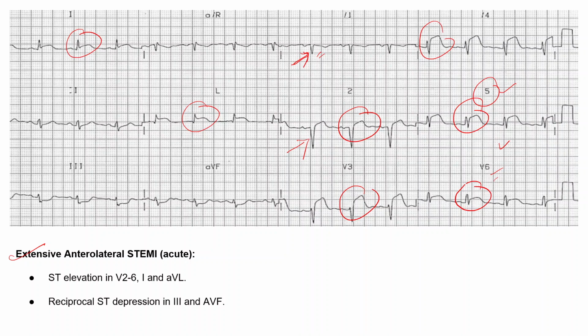And in almost all the cases you will get the reciprocal ST depression, and you can appreciate here in lead 2 also there is ST depression, lead 3 also there is ST depression, AVF also there is ST depression. Okay, so these are reciprocal ST depressions.